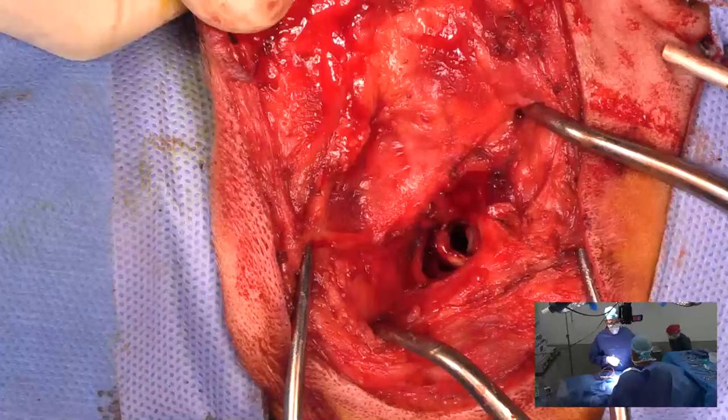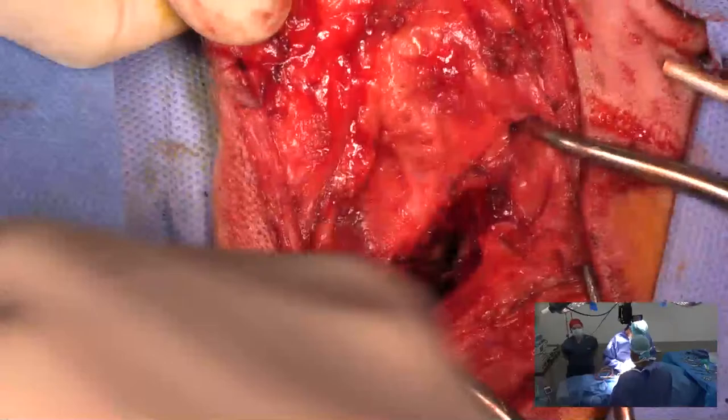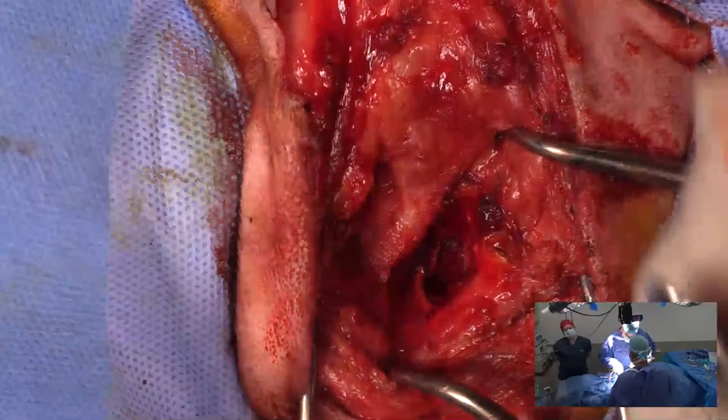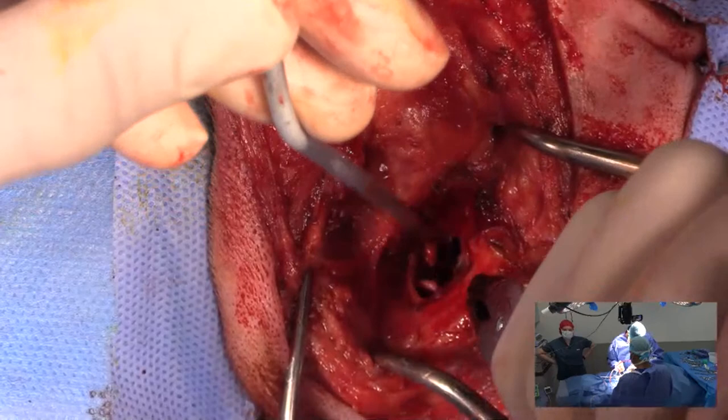All right, so now I can stick my rongeurs in. I'm just taking out a bit of residual ear canal that I didn't take out with my osteotomy, and I mean with my excision, total ear canal ablation. Now I've got a blade of the rongeur in the tympanic bulla. And there is a blood vessel here, which is a branch of the carotid artery. I don't think I got it, but they can bleed significantly if you do get that.